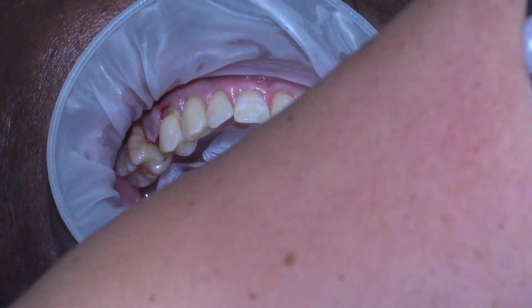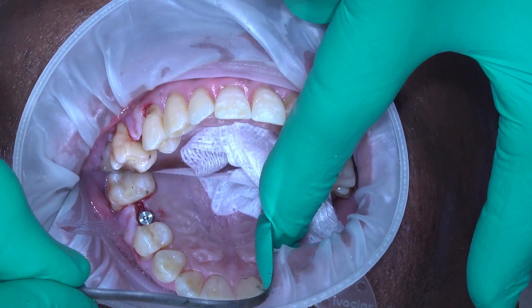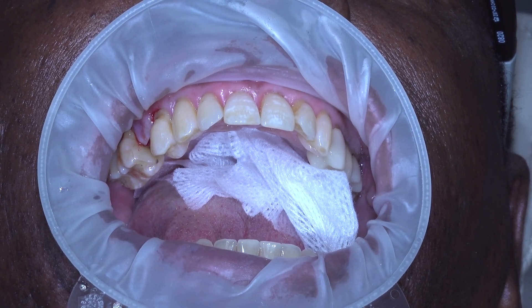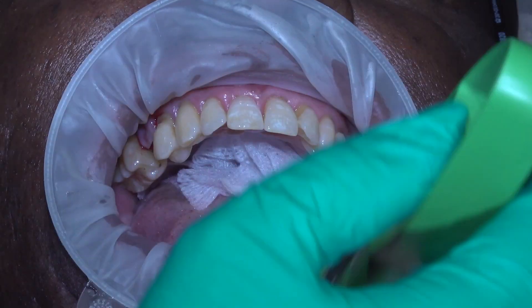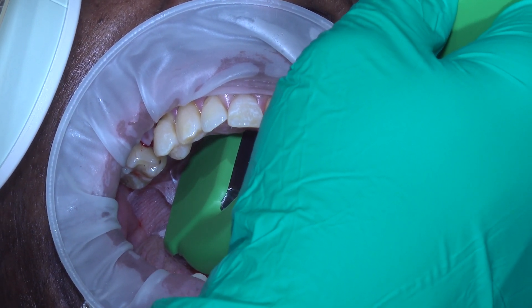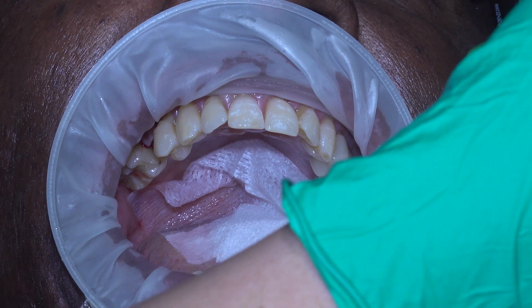We use our finger to re-approximate the keratinized gingiva on the buccal, and it's a little floppy. I don't like that, so we're going to place a suture around it. We're going to verify that the healing abutment is down before we place the suture. We use a Nomad radiograph in handheld XCP holders — they're great for implants to allow you to get the proper angulation so that the radiograph is perpendicular to the platform of the implant. We want to make sure our abutment is down, and if you don't get that radiograph perpendicular, it's difficult to see that interface.